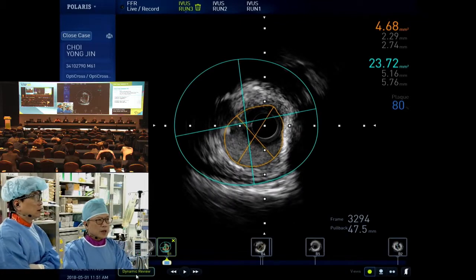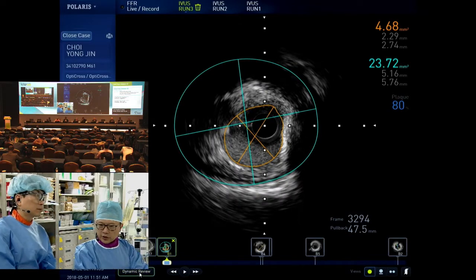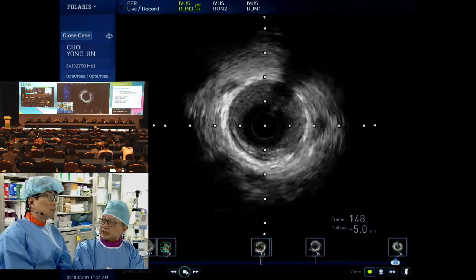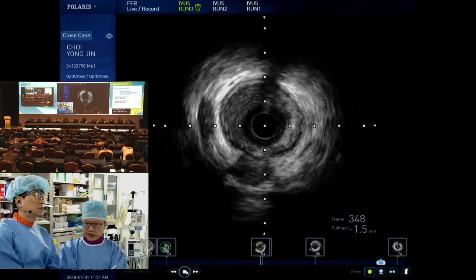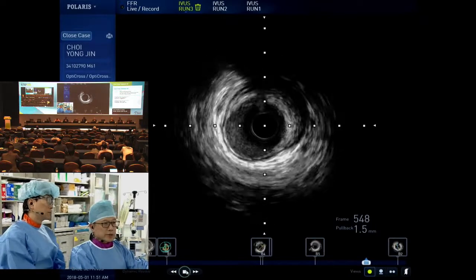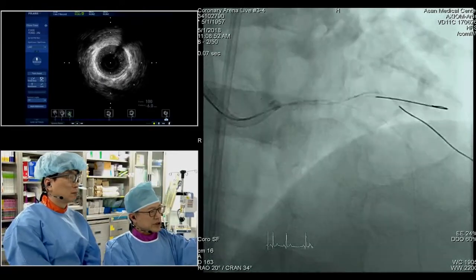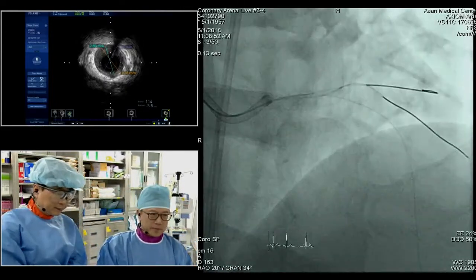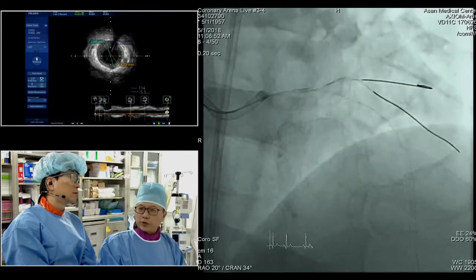Yeah. So just to summarize, I think from the angiogram and IVUS, the circumflex origin has a bit of plaque, but the lumen size is still pretty good, in the 4s. The Ramus origin looks pretty clean. The LAD is diffusely diseased, pretty much the whole proximal LAD, and then the tightest area is the distal left main. So we think if we want to go from normal to normal, which is on this angiogram, maybe go back to the angiogram. If we want to treat completely normal, it has to go distal to that diagonal, to that little septal, and we measured the distance, it's 60 millimeters. Yeah. But if we want to treat somewhere in between, then it's probably a 38 or 32.